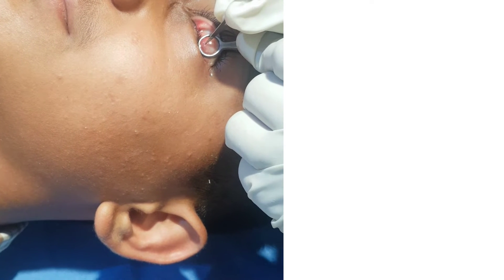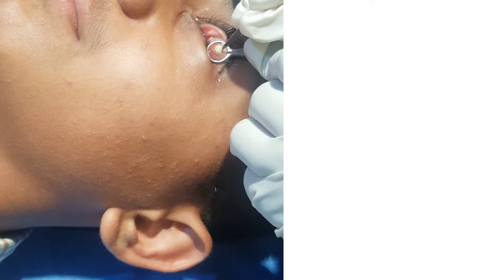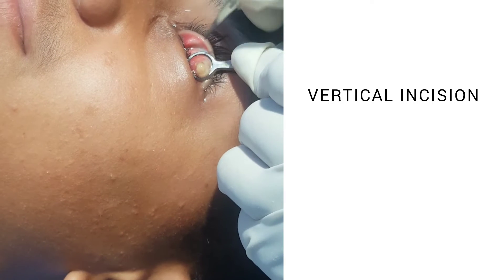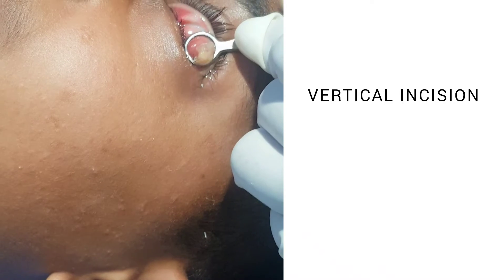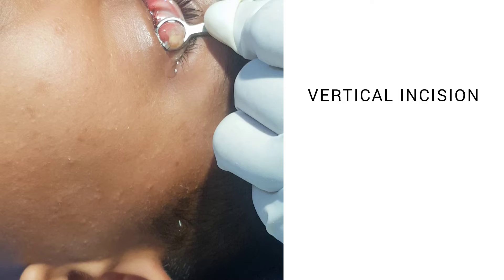While removing the chalazion from the conjunctival side, as we are doing in this video, we must make a vertical incision because that is how the meibomian glands are oriented. If you make a horizontal incision, you will end up cutting the adjacent uninvolved glands as well. So make sure that your incision is a vertical incision on the conjunctival side.